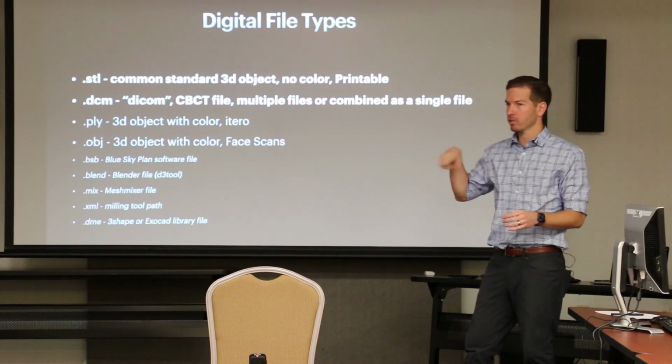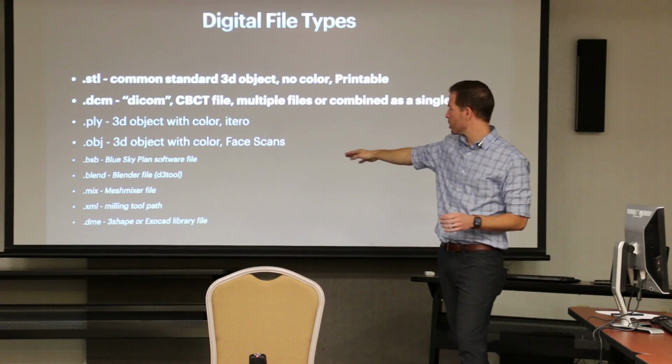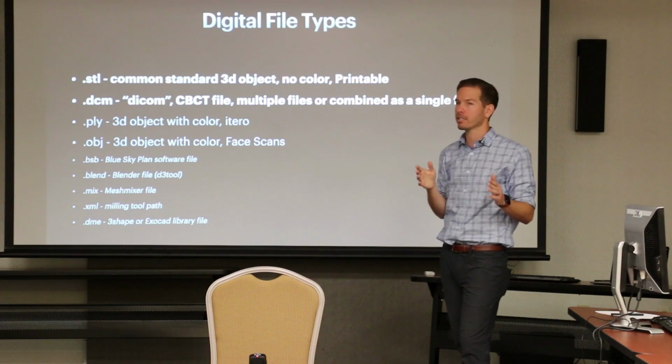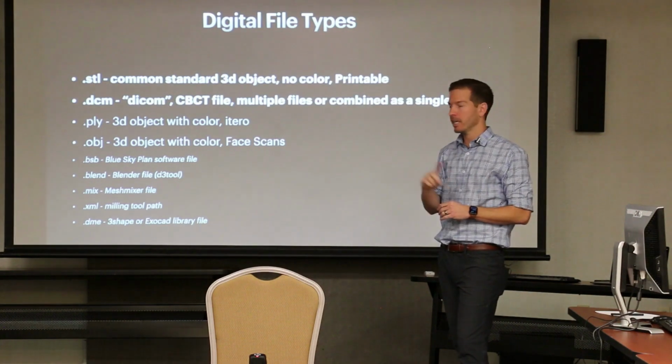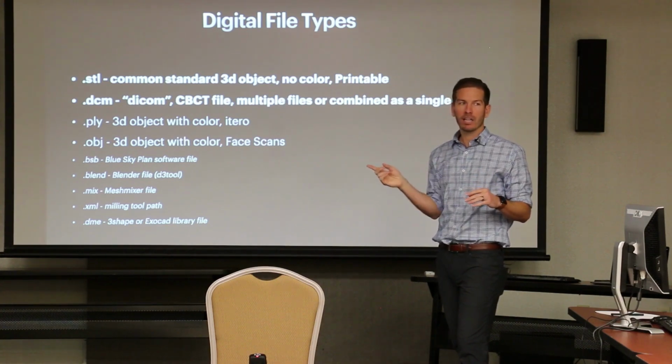That's your universal file. So those are the file types that are specific to those software that you're not actually dropping in and printing and working with. But if you want to save the file for future editing, then you'd open that back up.